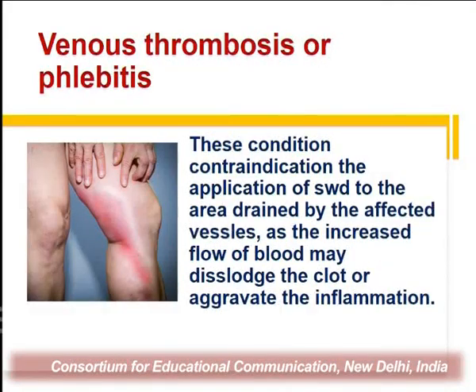The next one is venous thrombosis or phlebitis. These conditions contraindicate the application of shortwave diathermy to the area drained by the affected vessels, as the increased flow of blood may dislodge the clot or aggravate the inflammation.